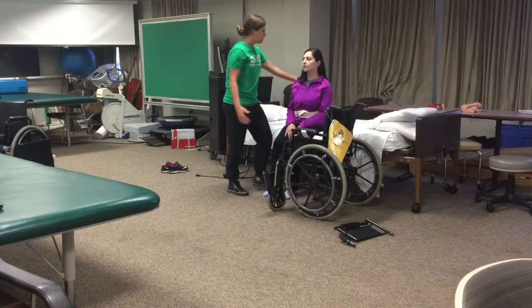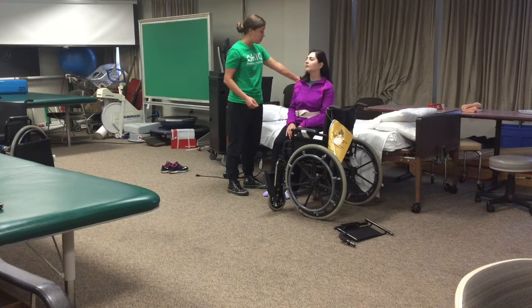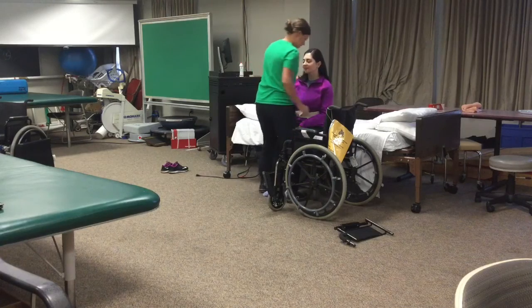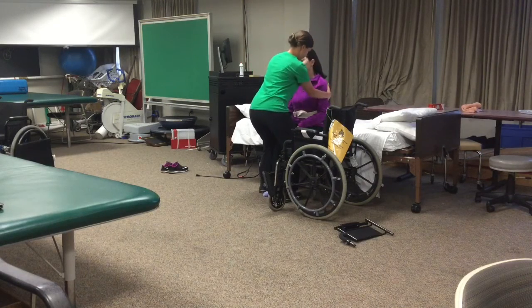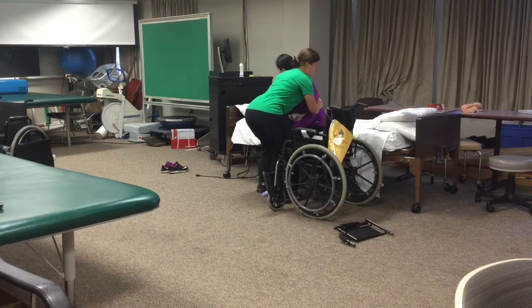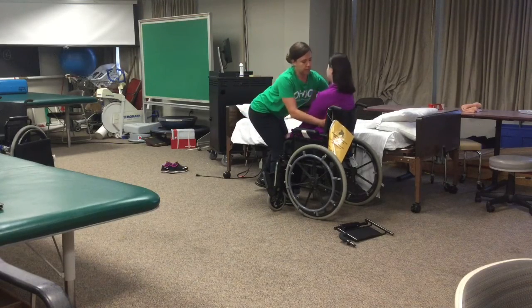Okay, Susanna, we're going to move to the wheelchair. Are you ready for that? Okay, I'm going to position you, and I'm going to cue you 1, 2, 3, up. We're going to rock for 3, raise up, pivot, and then lower into the seat. Does that make sense? Okay. Ready? 1, 2, 3, up, pivot, and lower.